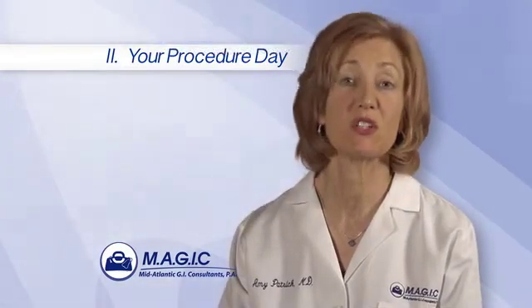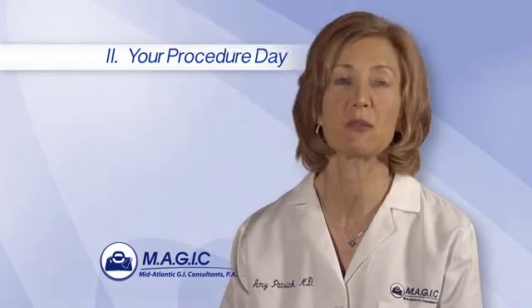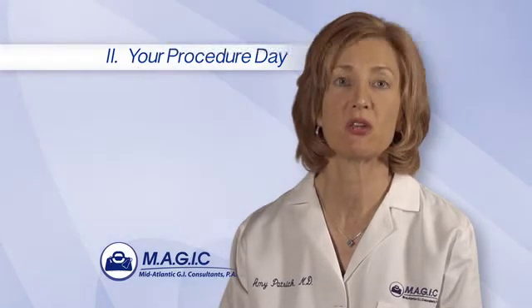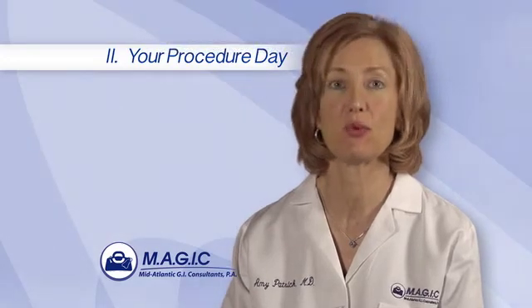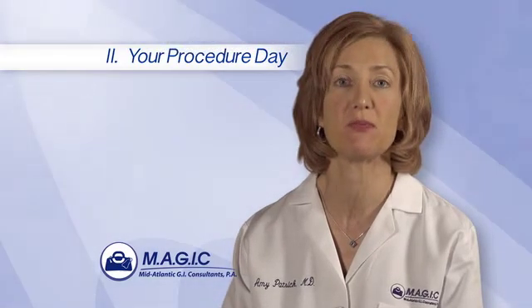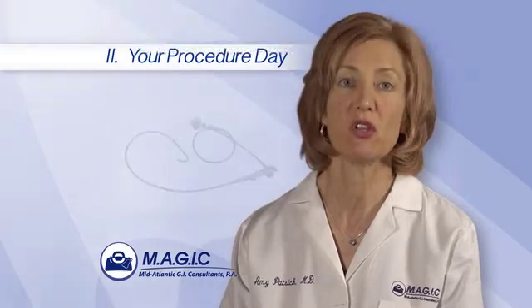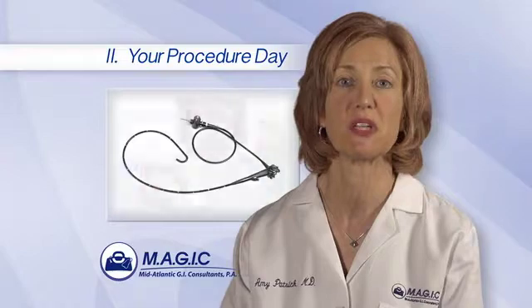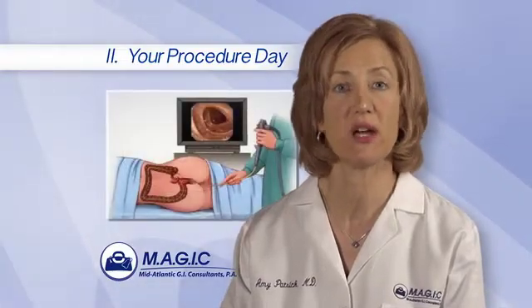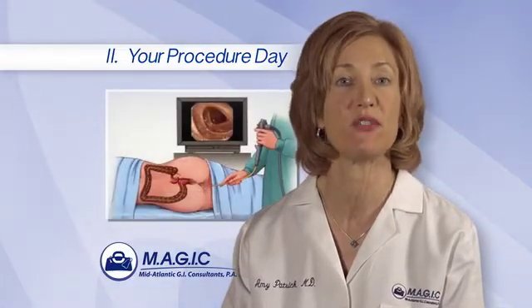When your GI doctor is ready for you, you will move to the colonoscopy exam room. Routine monitors will be applied. Your sedation will be started and you will fall asleep before your doctor begins your colonoscopy. Your doctor will insert the colonoscope, which is a flexible tube with a light on the end, into the rectum. The colonoscope is advanced the entire length of the colon, which is about 6 feet.